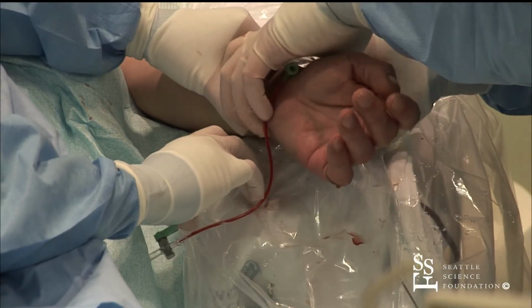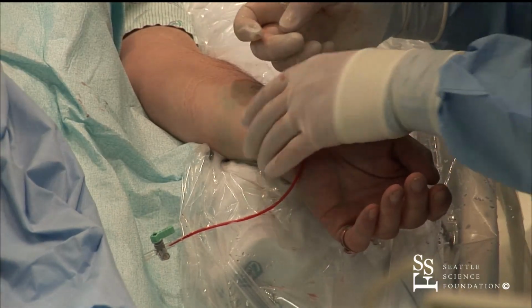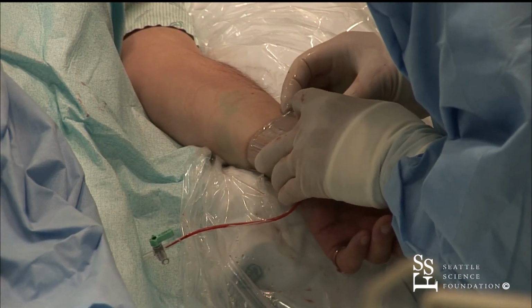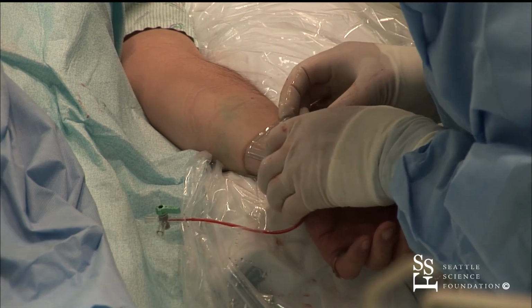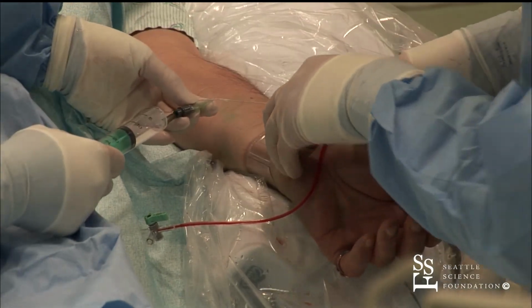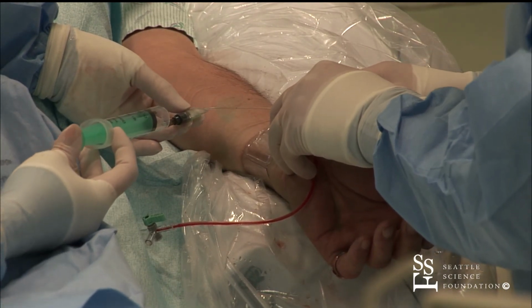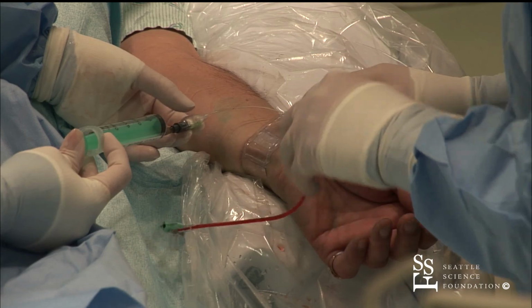So what we're going to do is basically put this on, not real tight, but just snug, so that it's not going to move around. Okay, and then there's a bladder inside here that's an air bladder, basically. And get that up there where we want it. Okay. And then Laura's going to, I think it works easier if it's a two-person operation, so she's going to put 13 cc's of air in the band. Okay, and then I'm going to pull the sheath.